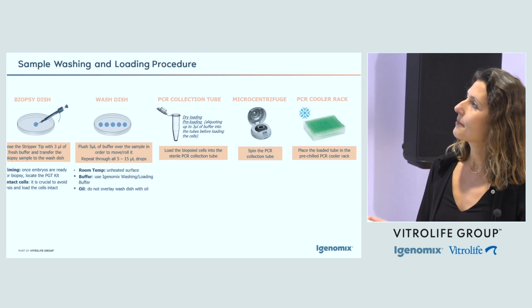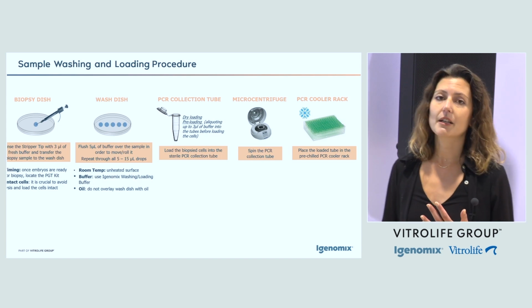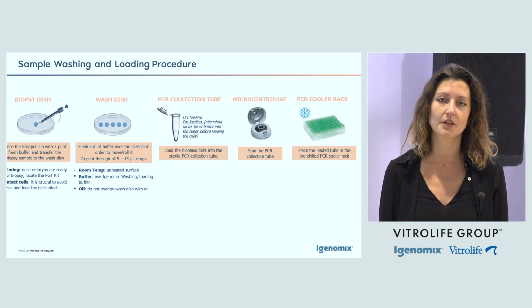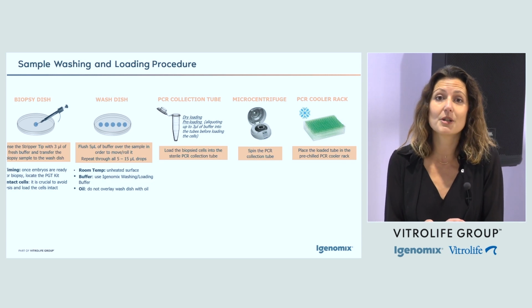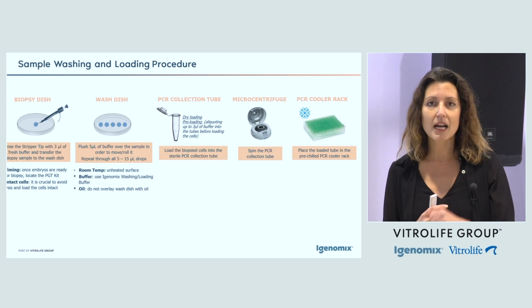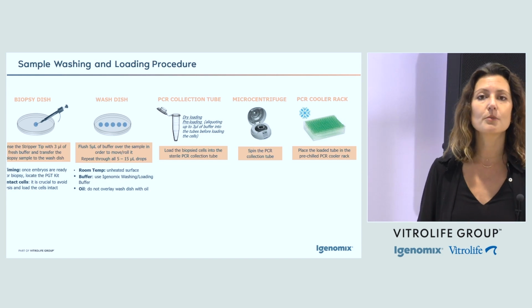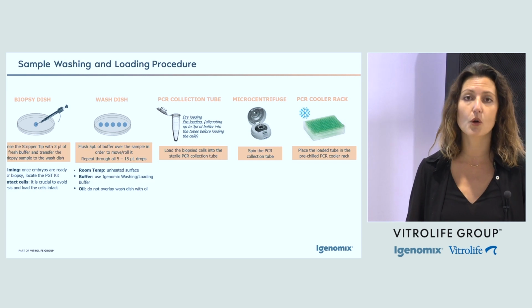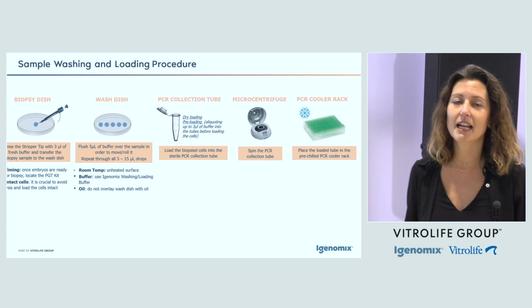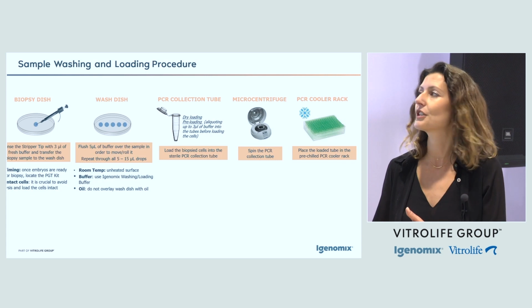Within the second step, which would be the wash, there are a few things that are very important. The first thing, when you are working with embryos, you want to have 37 degrees Celsius, just because you want to keep the embryos in a good environment. However, that's not the case after the biopsy. Once you have those cells, you just need to be working at room temperature. So just be sure that within your hood, it's an unheated surface. That's very important, and it will be related again with the quality of the DNA and the non-informative results.